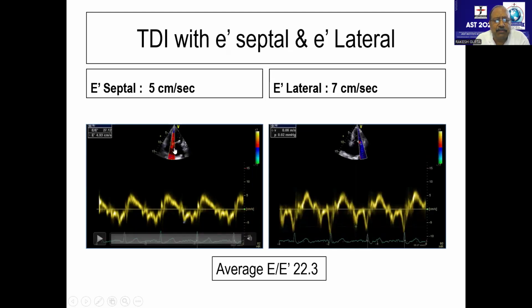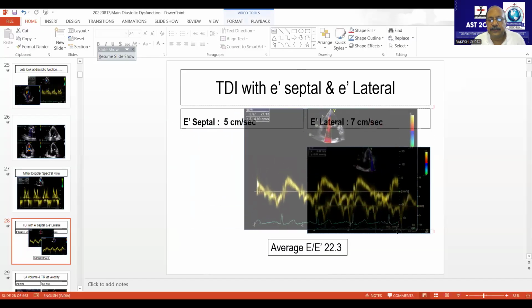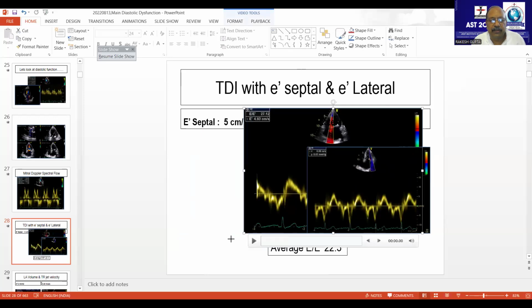One fine man, one morning, he got up and said, I'm not going to look at the flow velocity through the valve. I'm going to look at the contraction of the myocardium. And very intelligently, he employed high flow velocity filters to get low flow velocity signals of the LV contraction. Let me explain what this tissue Doppler imaging is in a bigger sense before I go to further evaluations. So I'm going to do that for you.